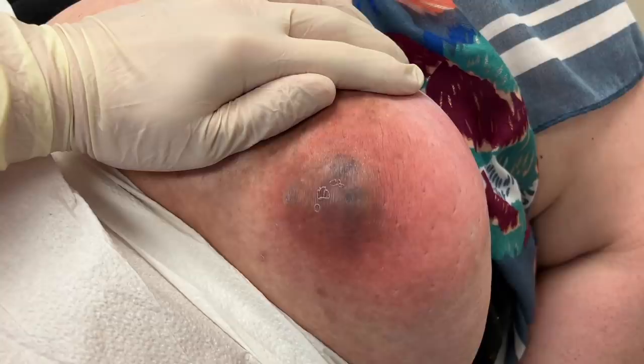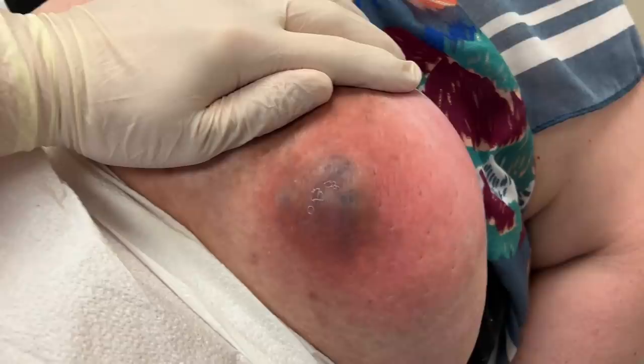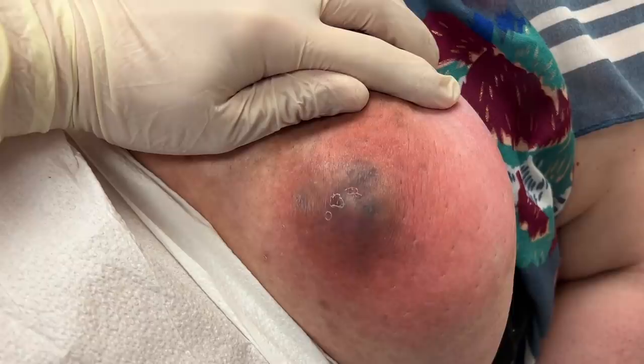Hey guys, Greg Lynch here and we have one of many things that we do, which is an abscess. This is on the underside of a breast and it's common in patients that are diabetics — they tend to get more infections. You can see here this is really inflamed. I'm covering the areola with my hand and this is the outer lower part of the breast. So this is very red, very warm, and very tender.